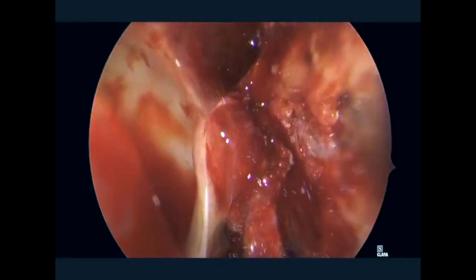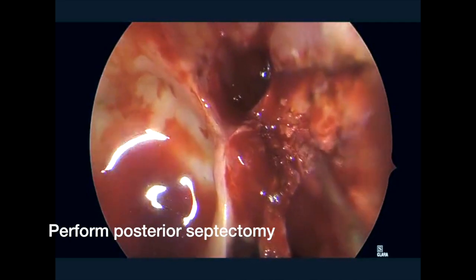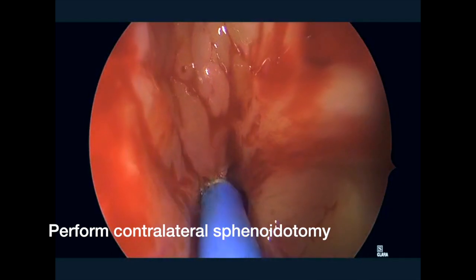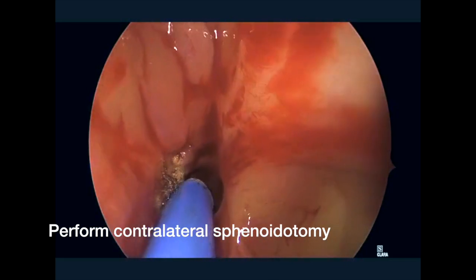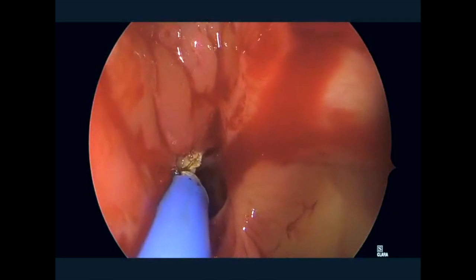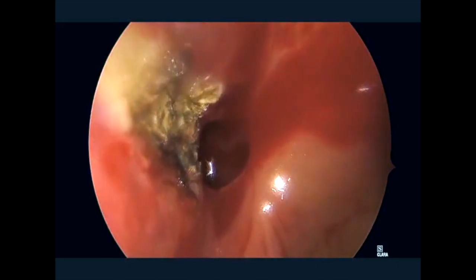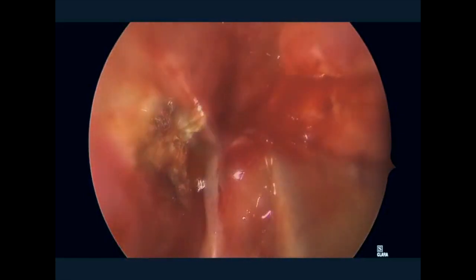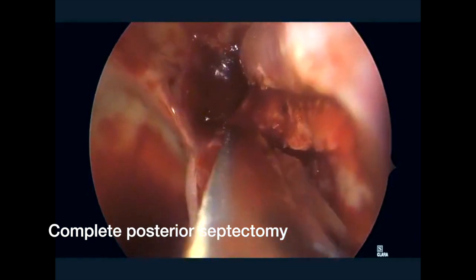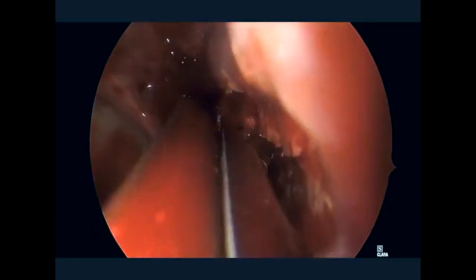We then perform a limited posterior septectomy and raise the contralateral flap off the face of the sphenoid. This is the contralateral left side. We're ablating the mucosa on the posterior septum — this is essentially the opposite side of the mucosal flap that we'll be raising to cover the bony opening. That mucosa is ablated and removed, the sphenoidotomy is opened widely on the contralateral side, and we complete the posterior septectomy to create a common sphenoid cavity between the two sides to ensure good drainage postoperatively.